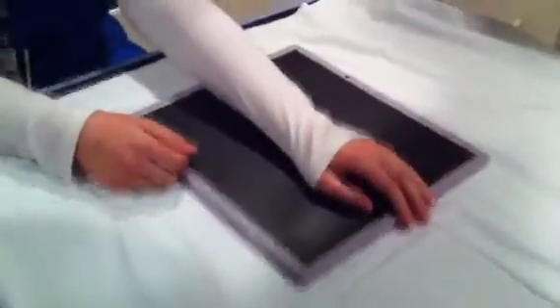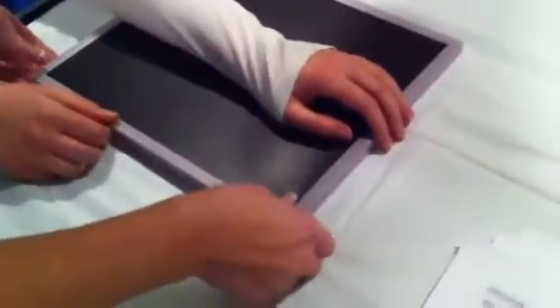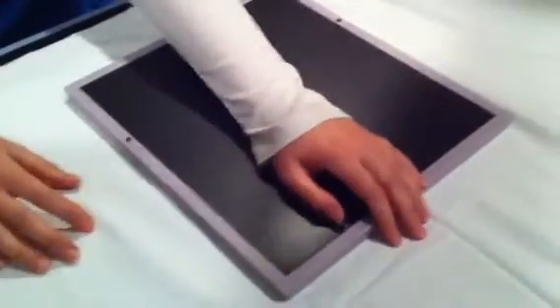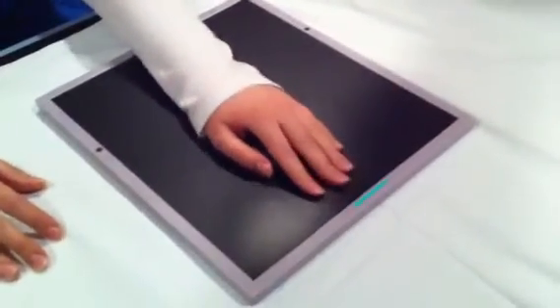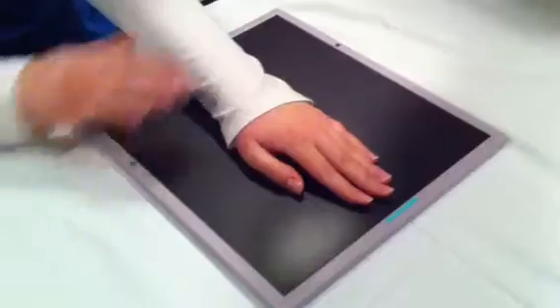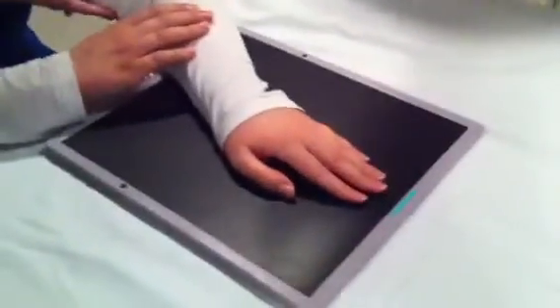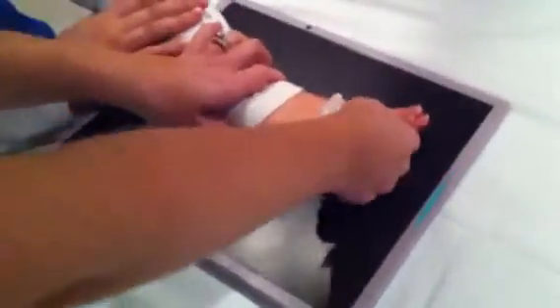Rest the forearm on the table. You kind of want, if you can, in the same plane, to have your table up. Pull up your sleeve. Hold one hand over the joint to keep it in position. Move the elbow away from the patient's body, then turn the hand outward until the wrist is in extreme ulnar deviation.